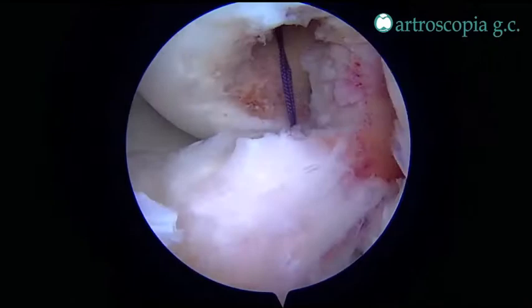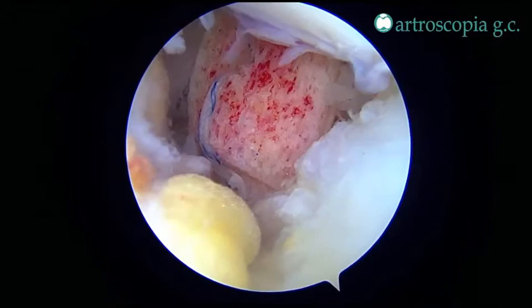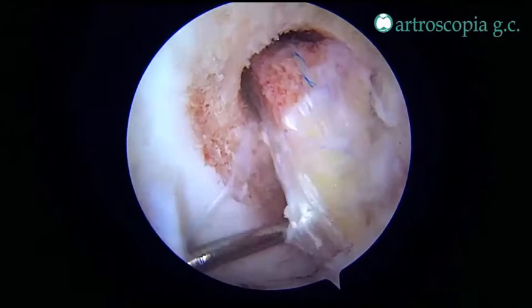Then a suture is used to check isometry throughout the full range of motion and bring the graft inside the joint from the tibial side to the femoral side with the help of a probe.